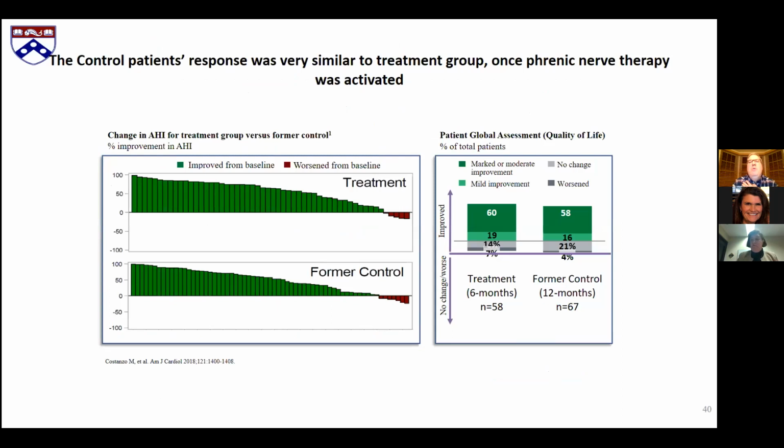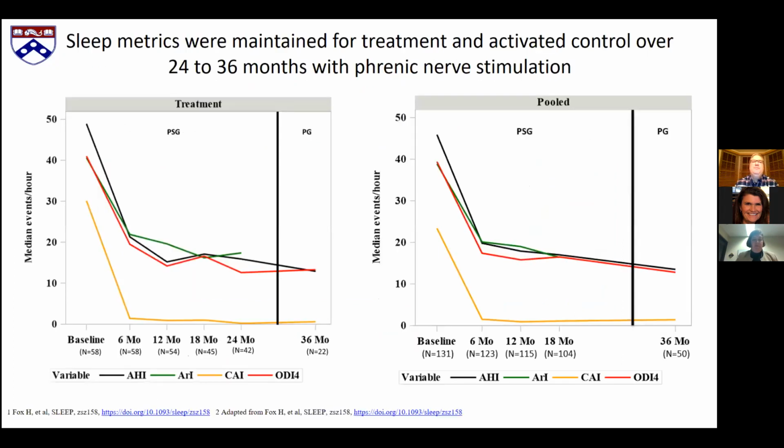You know, we always worry when we place a device, is there going to be a big placebo effect? And in this case, we showed that no, turning on the device is really what was driving the improvement in quality of life, as well as obviously the improvement in apnea and hypopnea index.